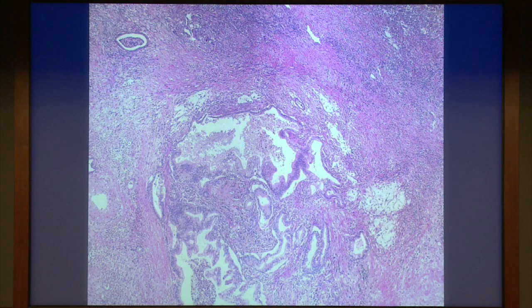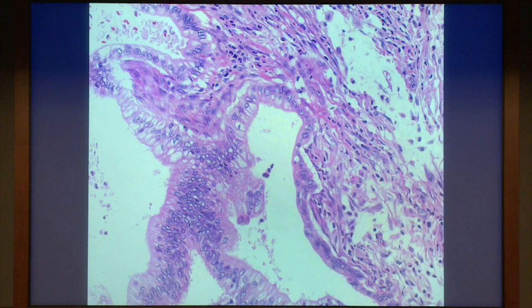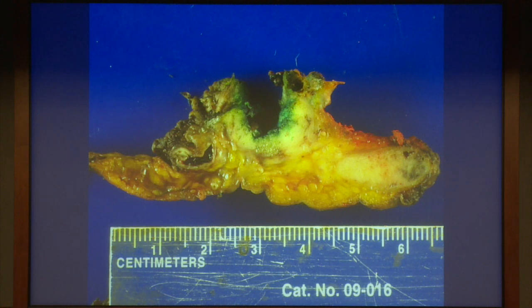So this is all blown to bits in an invasive adenocarcinoma of the pancreas, where the parenchyma is completely replaced by two things: cancerous glands in various density, size, and shape, and an abnormal stromal response, which consists of fibrous connective tissue and inflammation. So on high power, you can see these are some cancerous glands. The nuclei are somewhat enlarged. There's some mucin in the cytoplasm, and the purple dots here are lymphocytes. So that is pancreas cancer, gross and microscopic.